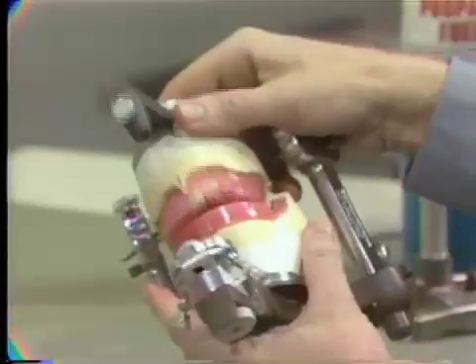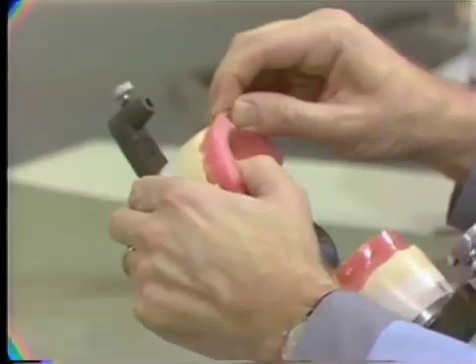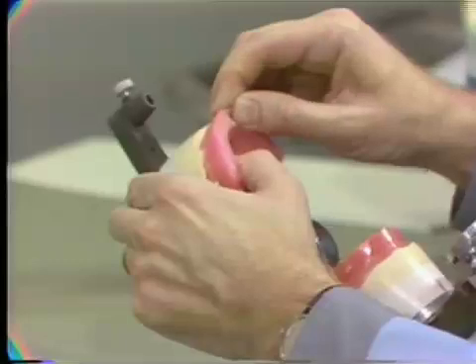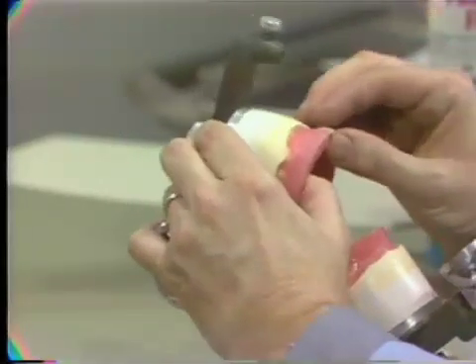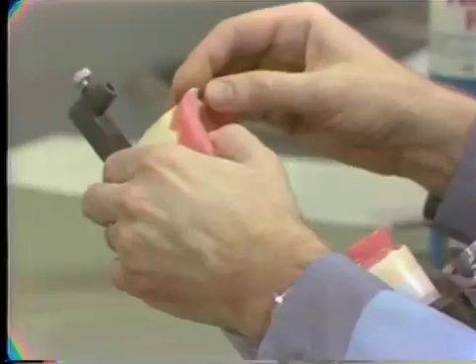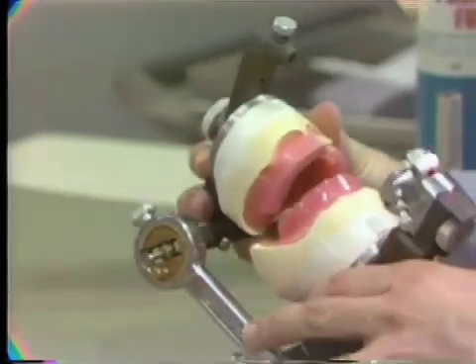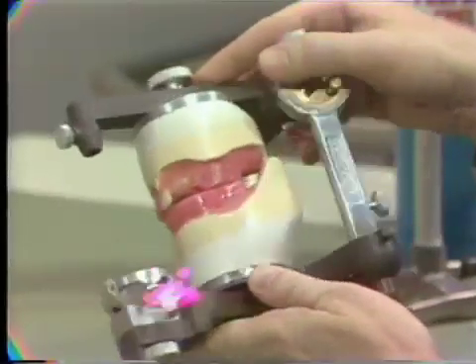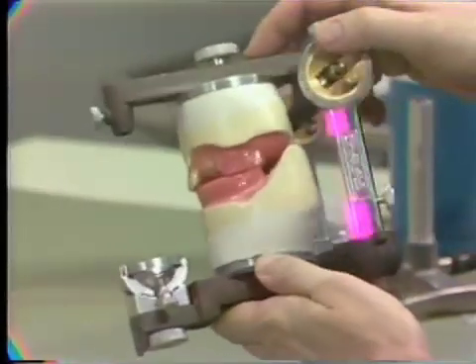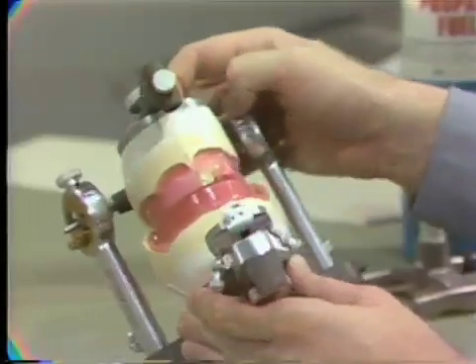The only tooth adjustment that I can see at this point to make on this tooth is to make that labial surface just a little bit more vertical and to bring the whole tooth down just a little bit, so I have indeed developed a little more vertical overlap or overbite. And at this point I would consider the first tooth set correctly and will now go to the lateral.